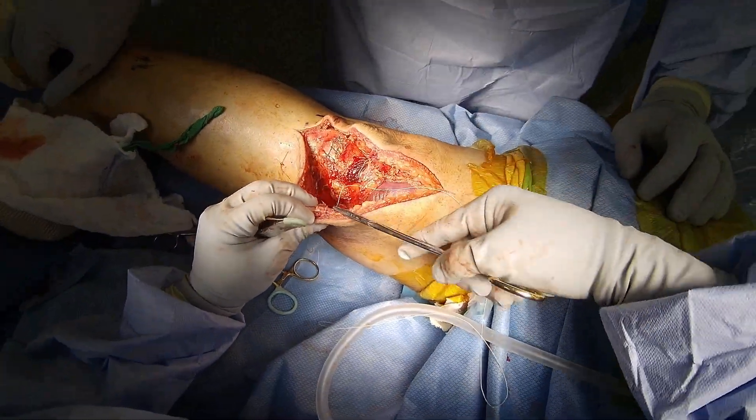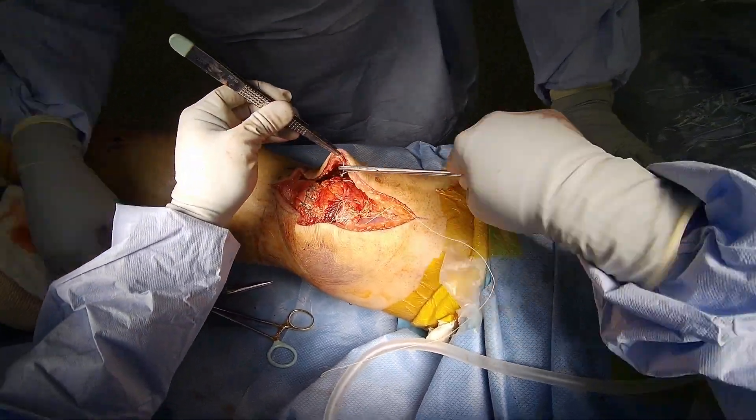I can also close the deep layer with a large number one vicryl. I place a drain to evacuate any short-term edema.